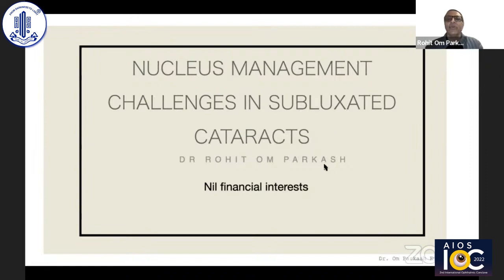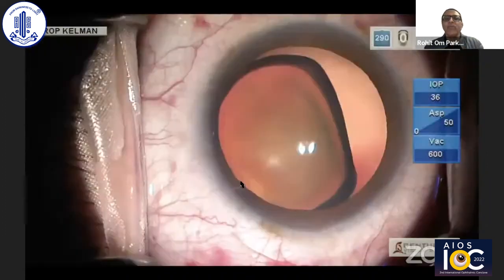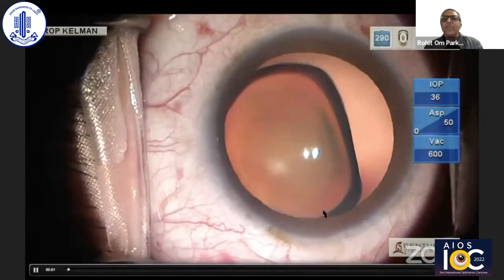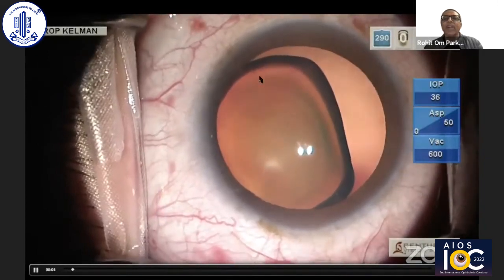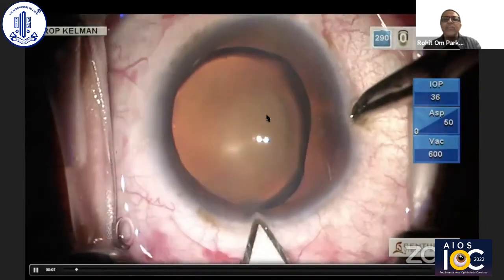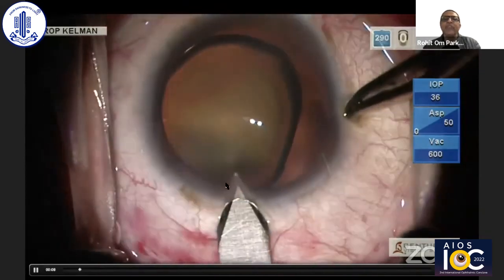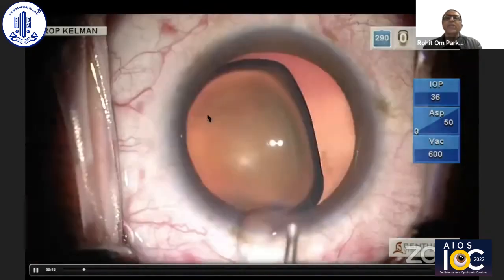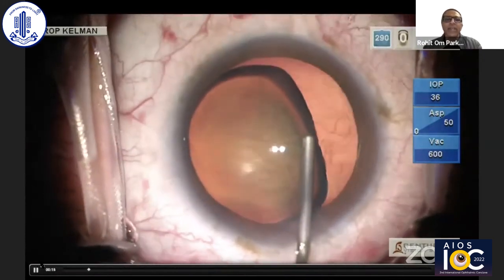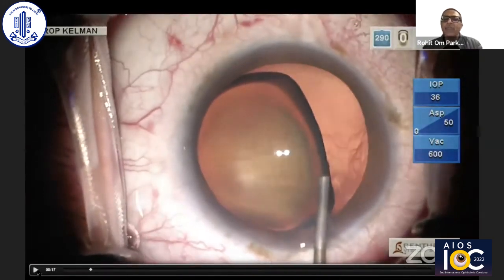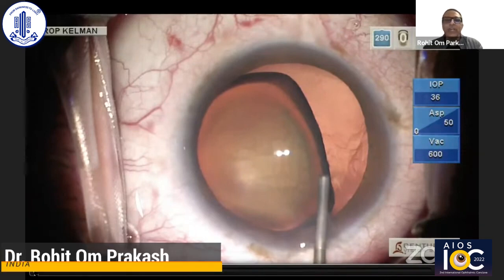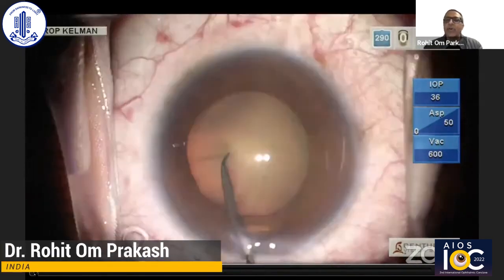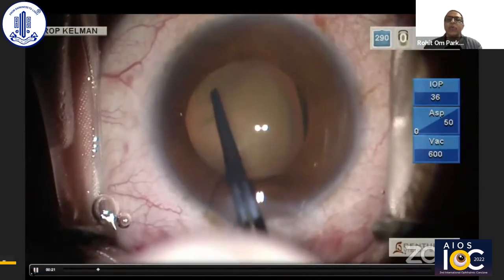In this patient, you will find that there is subluxation or zonular absence at more than 180 degrees. The strategy in these patients is to create an incision in the area where the zonules are present. I should have used triamcinolone in this patient to rule out the presence of vitreous, but since I was sure, I did not do it. The choice of viscoelastic is also very important — you can use a visco-dispersive followed by a visco-cohesive.